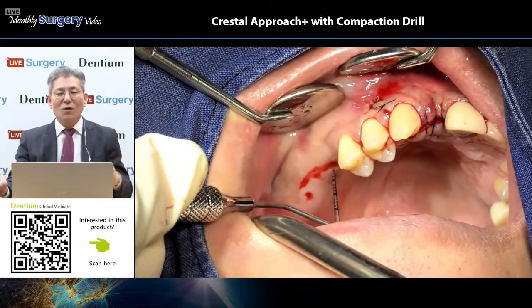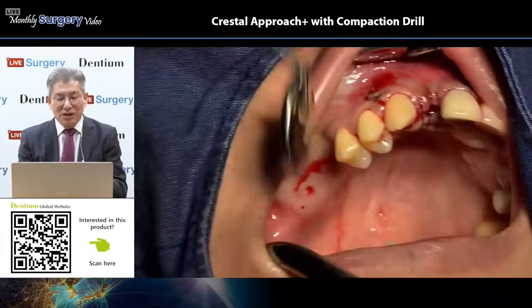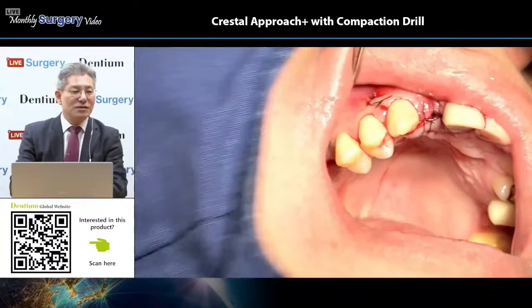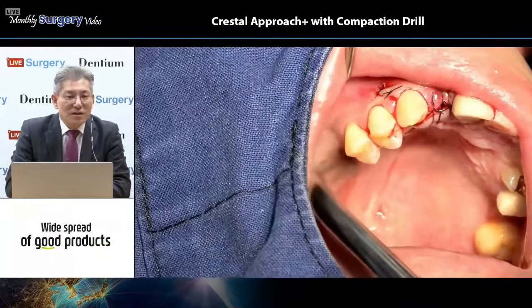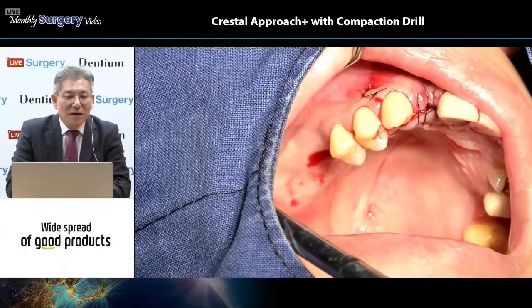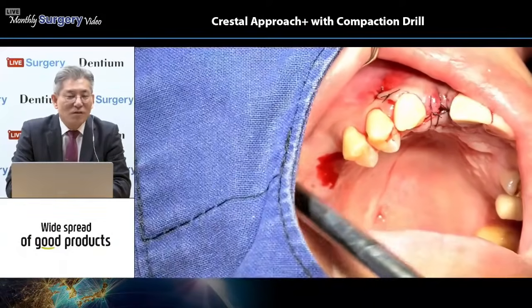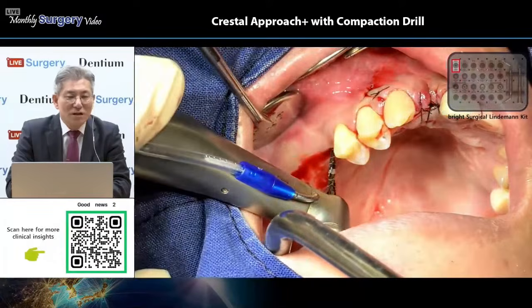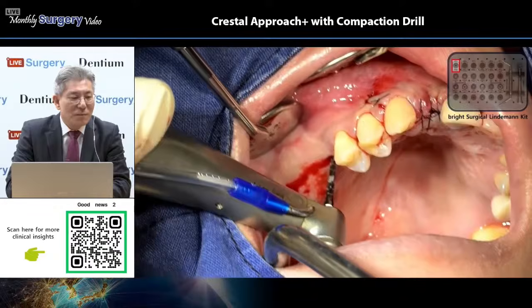Please remember all of this introduction of today's biomaterial as we move to today's surgery video. And you can see and find out some interesting points about using the biomaterial properly in this kind of crestal approach.